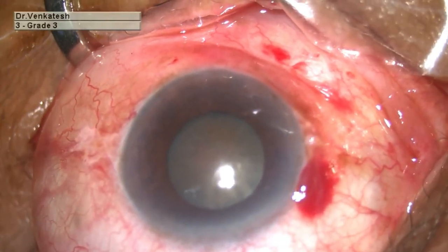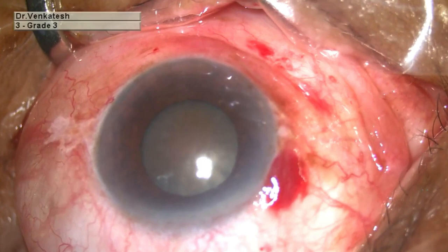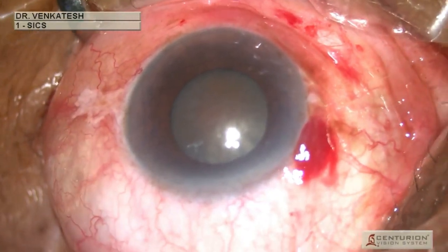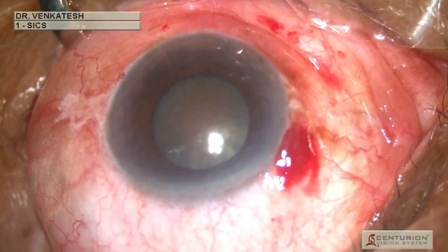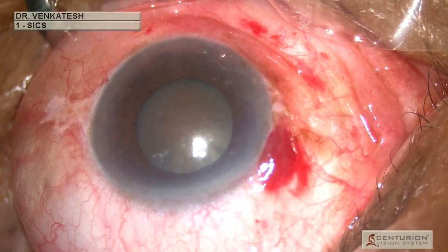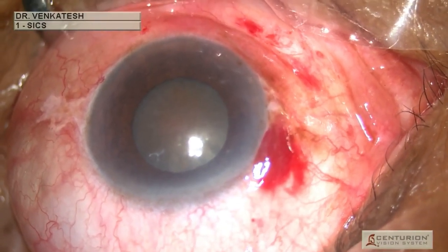This is the left eye of a 75-year-old man who presented with diminished vision for two years. On examination he had a brown cataract and a pupillary diameter of approximately six millimeters, so small incision cataract surgery was planned.